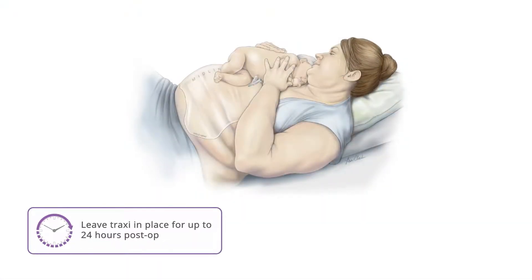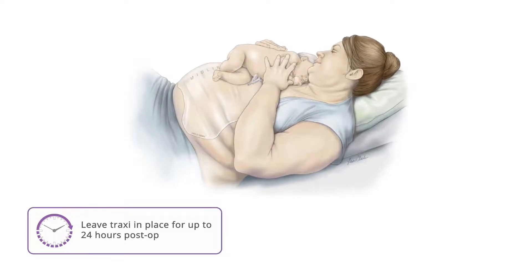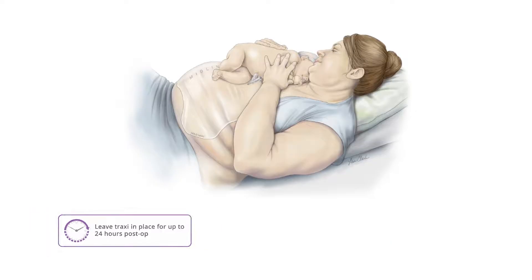If desired, Traxi can be left in place for up to 24 hours, which may aid in post-operative wound healing and wound assessments.